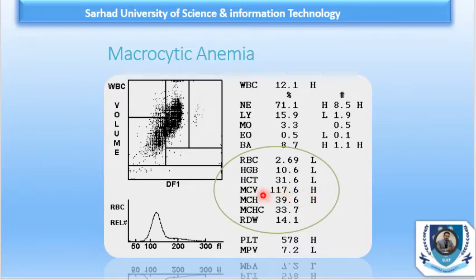So it's macrocytic anemia. Now here we have MCH and MCHC. Because the cell is large, here we have hyperchromia, but we cannot mention it because it's not a good term. And we have macrocytic anemia over here. Okay, RDW is normal, 14.1, because all have a uniform population, all the population is macrocytic, and platelet count is also high.